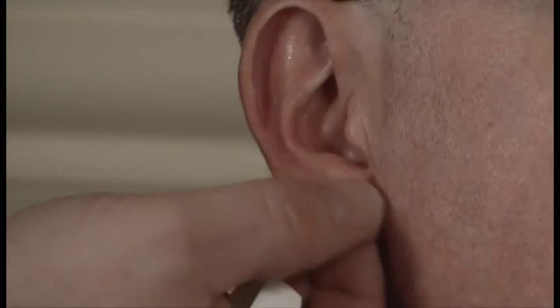Take an alcohol prep pad. Prepare the earlobes and the forehead, taking some of the oils off. Incidentally, the hair should be washed with shampoo with no conditioner and no gel. Use a little new prep on the earlobes, just a tiny amount on the fingertips to abrade the earlobe.